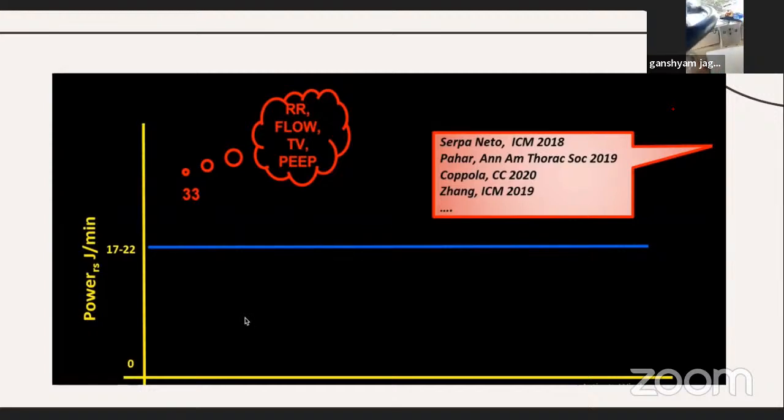Thank you, Arun. I think you have highlighted a lot of important concepts in a very, very simplified way. Mechanical ventilation over the last few years has become much more objective, with the ability to look at the different aspects of ventilation in this lung injury at the bedside.